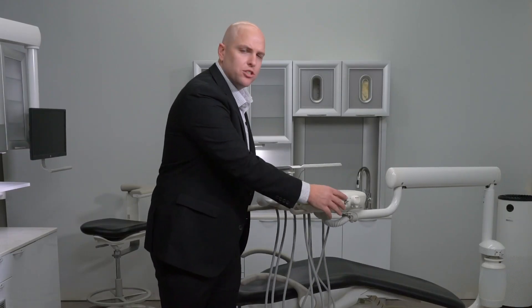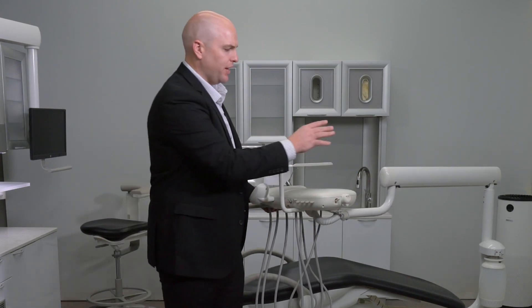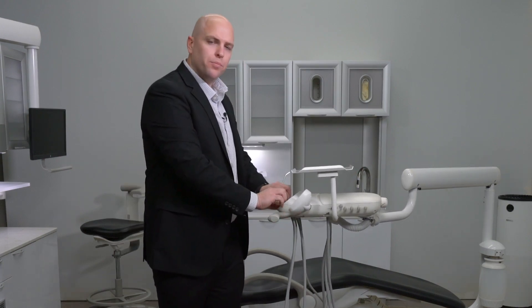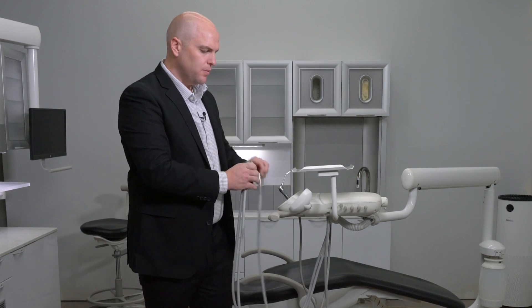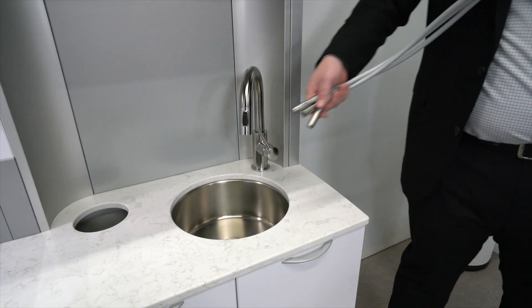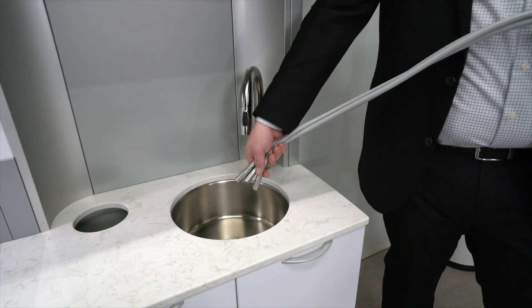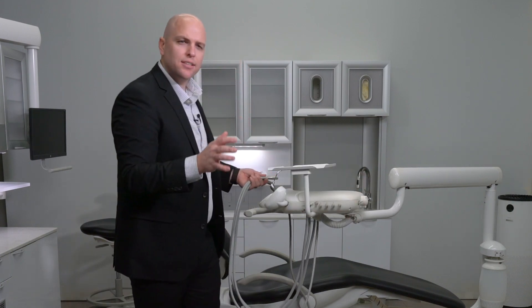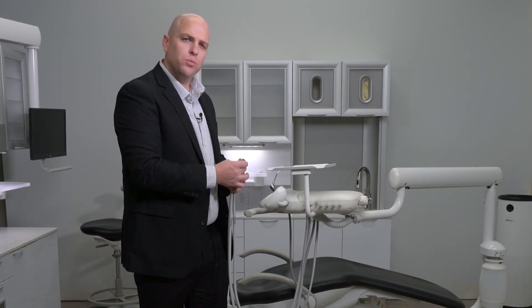As we continue to move around the back of the unit, you'll find your flush toggle. Before you can flush the unit, you have to make sure to put an empty water bottle on the chair. Remove the handpiece tubings, hold them over a bucket or a sink, and then engage the flush toggle. Hold the toggle for around 30 seconds or until all the water has been removed from the system.